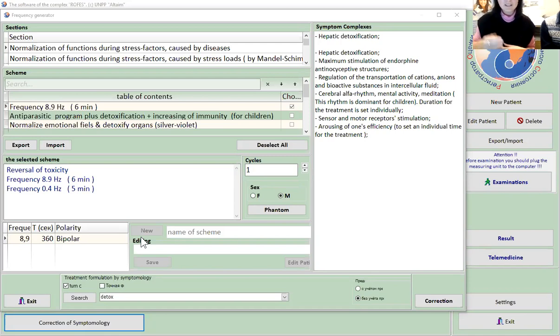It's like too much. As I said, if you write down like six frequencies here, probably the body will react too much. The person sometimes feels not well, because what you do with the Aquatone and Triomed, they stimulate the membrane of cells. They start to also clean themselves. So all this toxic stuff that's still in your body, you feel it. It's not a cleansing of one particular organ. Everything starts to clean itself. So drink more water, it usually helps, and maybe a little bit of salt also.